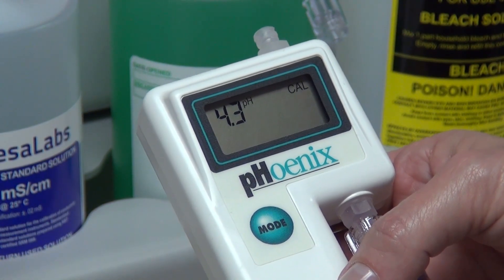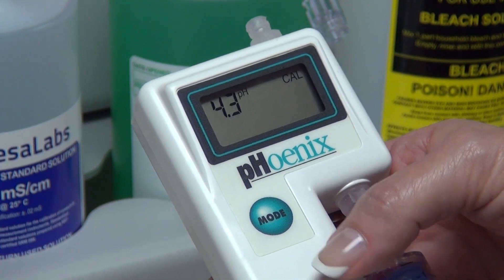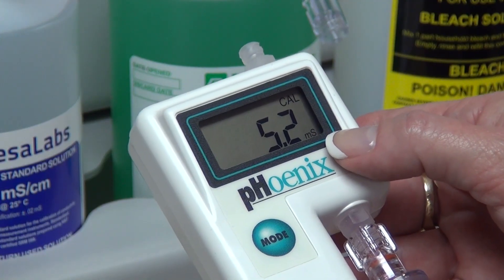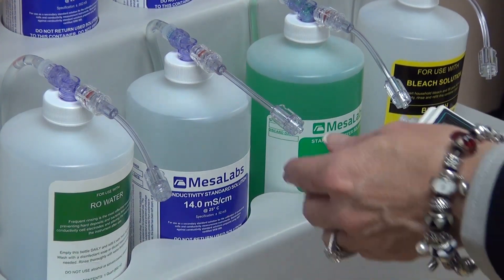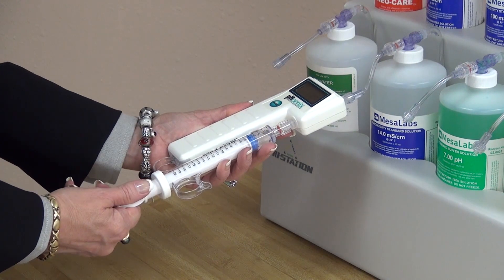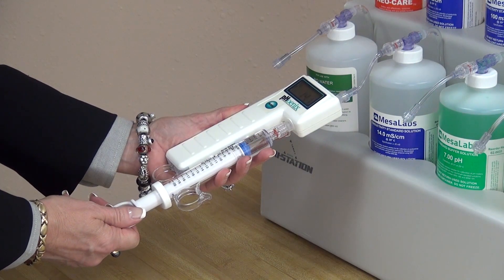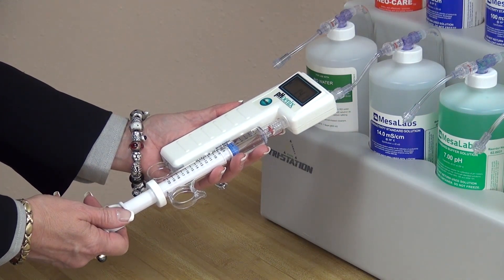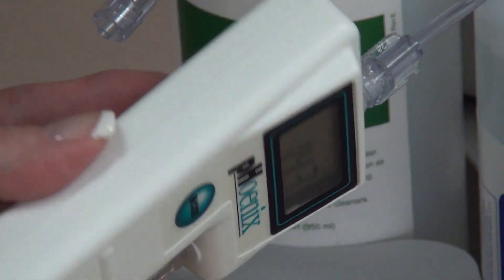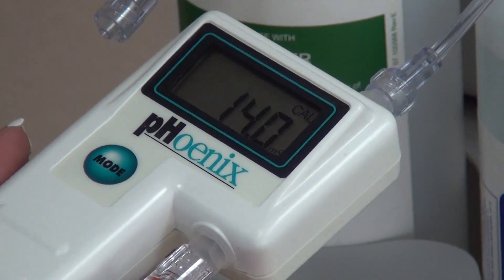To adjust mid-range conductivity — 2.0 through 19.9 millisiemens — press the mode switch until the conductivity function is displayed. Now we are in conductivity only. First, you will want to connect your Phoenix Meter to the 14.0 conductivity solution. Initially flush 14.0 solution through the cell, then draw a sample and observe the reading while it is flowing. When the reading stabilizes, press the up or down switch to change the displayed value to match the solution value.